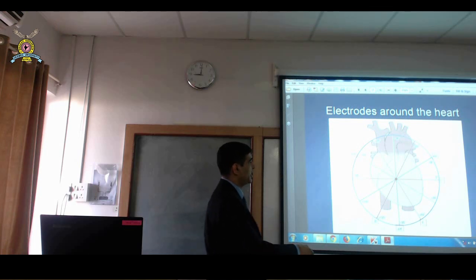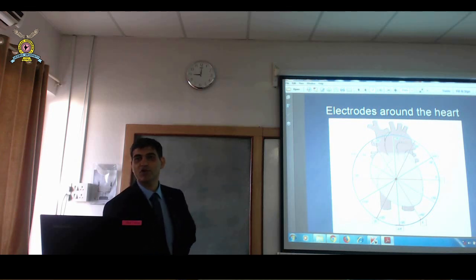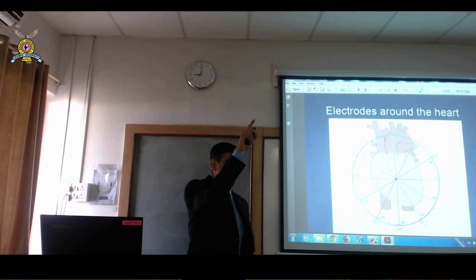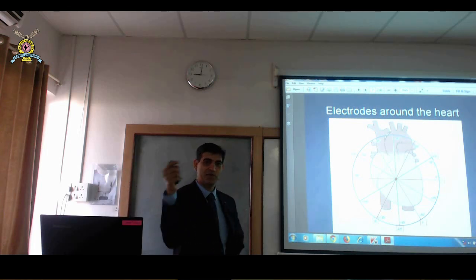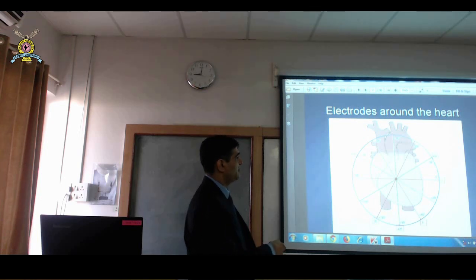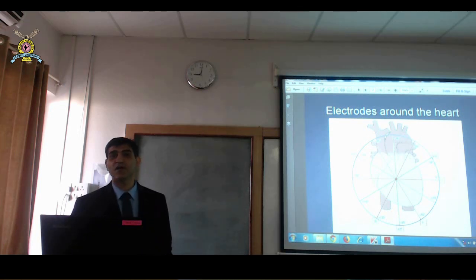And then on top of that, you have lead 1, AVF, AVR, AVL. Okay, so that is where they are placed. Got it? Okay, so don't remember AVR, AVL, remember a circle and remember the angle. Okay, starting from 0, 90, 180, 270 and 360. Right? Back to 0. So that's one thing. Now how you look at the heart is you look at the heart on this circle from different angles. Okay? So I'll come to lead 1 and AVF when I calculate vectors, when we calculate axis.